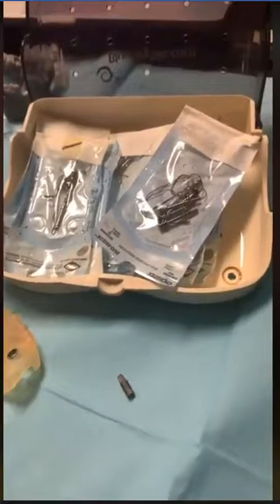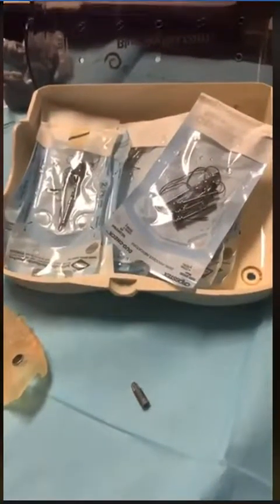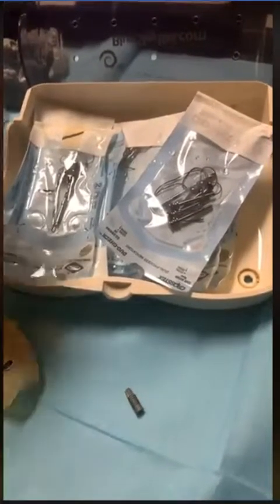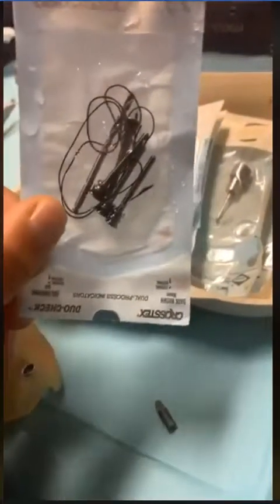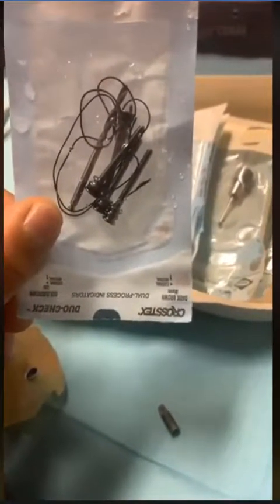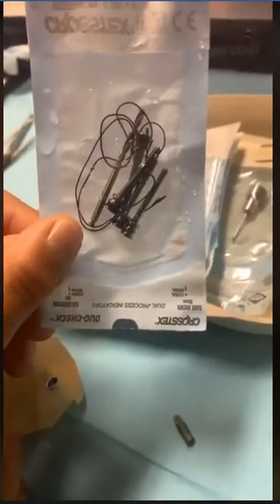These are all the other stuff that does not come included, and I make it specially for the kit that I use. I have these fixation pins that I bought separately, and I put it in here with a specific burr, and I'm going to show you what we do with that. That way I can go ahead and make the osteotomy for the fixation pins. Then I have this connection that actually comes with it with a hex driver.